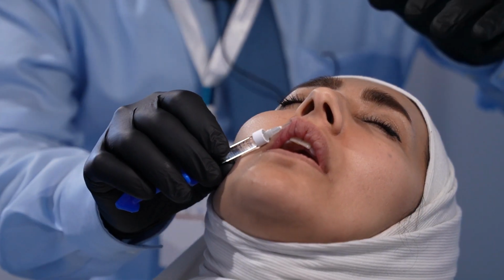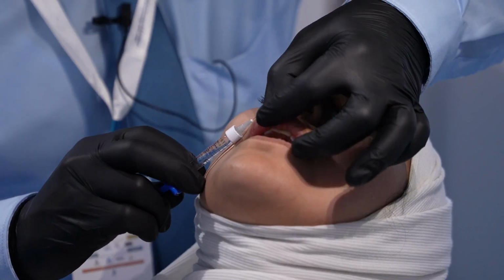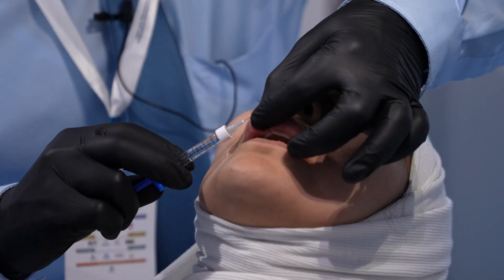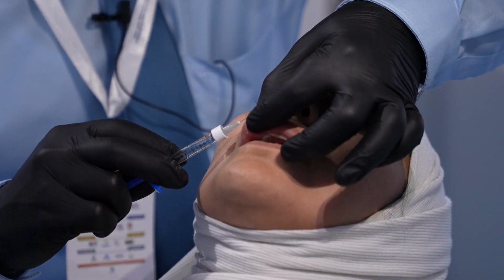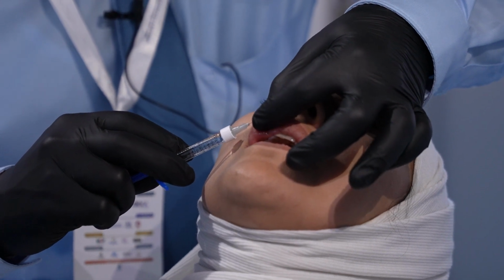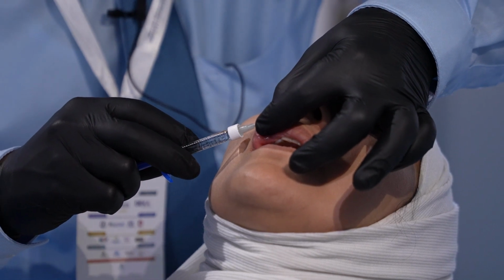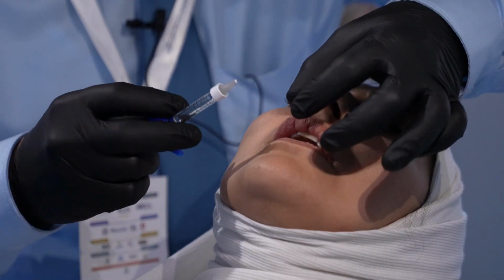Of course, we cannot say that we 100% secure the pain. There will be some, but just look at the vermilion border. Go within the vermilion border. How do you know that you are in the vermilion border? That there is a resistance. The tissues are not like that of the.